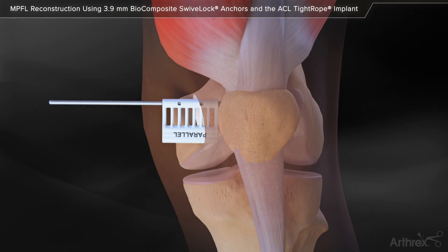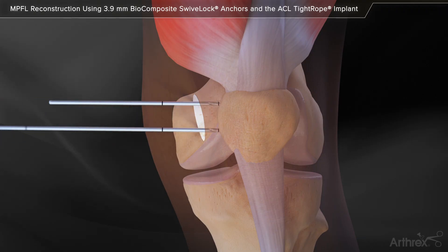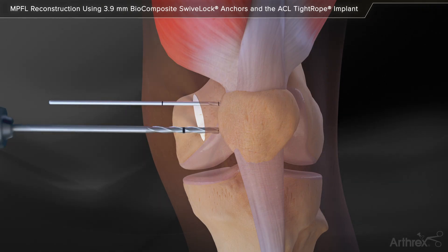If using the parallel guide, drill the 2.4 mm guide pin to the second laser etch mark off the parallel guide. The longer guide pin is placed 15-20 mm distal and parallel to the first guide pin using the parallel guide. The parallel guide is removed and both 2.4 mm guide pins are over-drilled with a 4.0 mm cannulated reamer to the laser etch line.